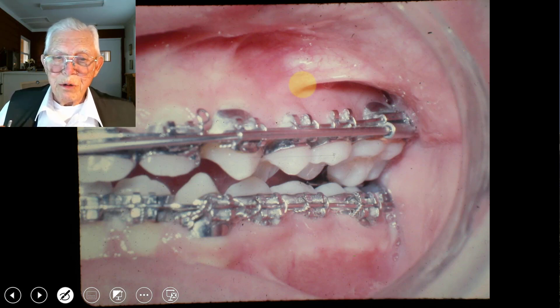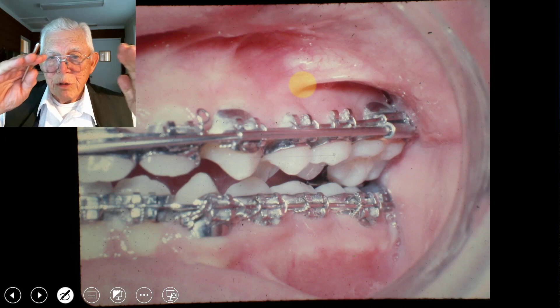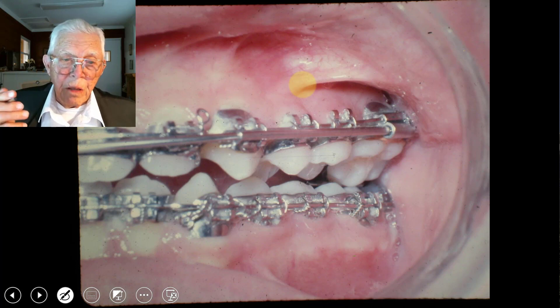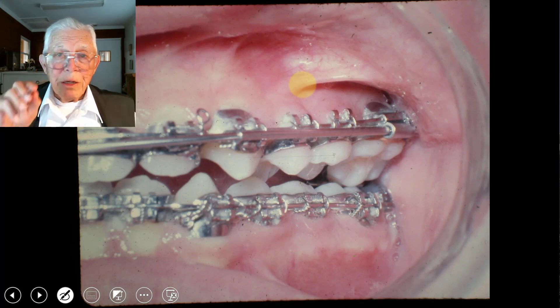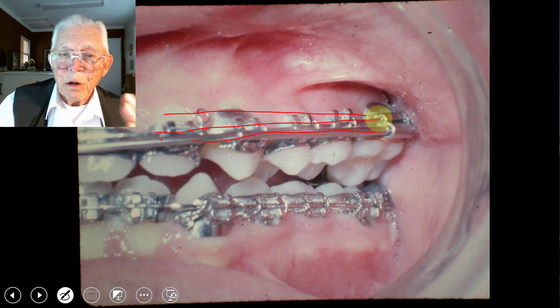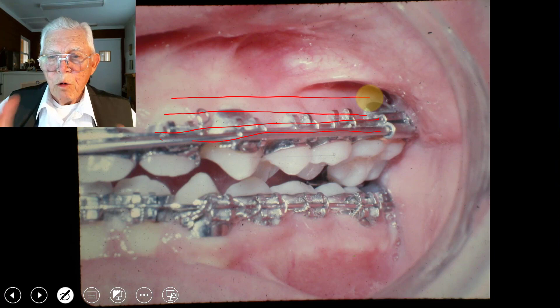Do not put this big wire on there on just a round arch wire or something — it will cause this to happen. The roots will just swing in like that, the crown will go up, and that actually reduces the airway instead of increasing it. You can expand anybody's teeth — I don't care who they are — and you don't run them through the bone structure if you just put a moderate amount of pressure and keep this buccal root torque. Those teeth will go out as wide as you want them, they'll be parallel, and there'll be bone structure on those teeth.